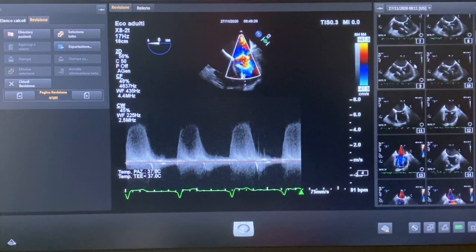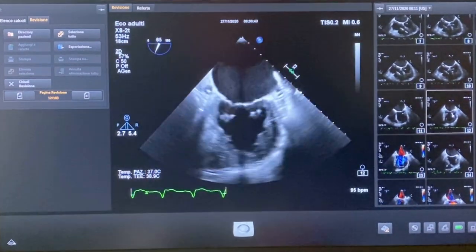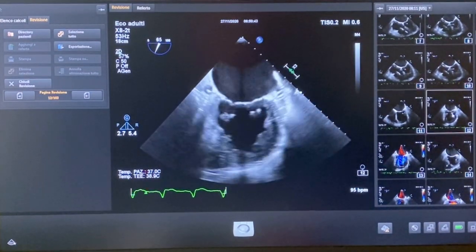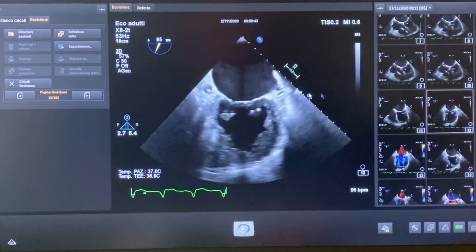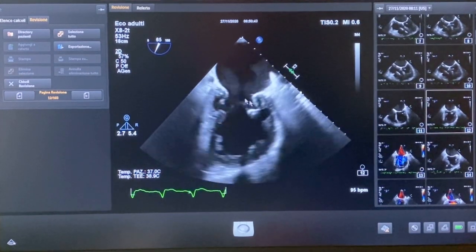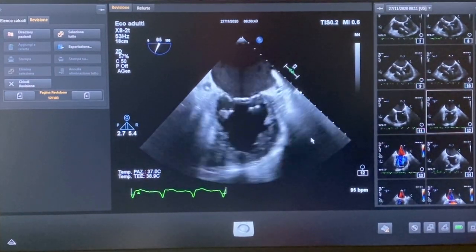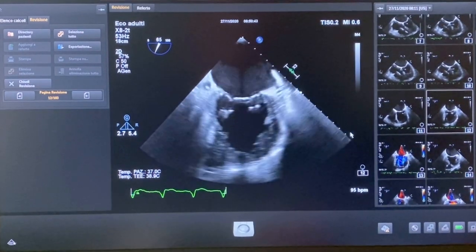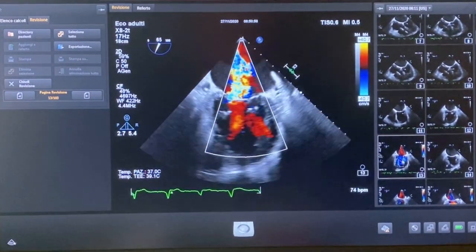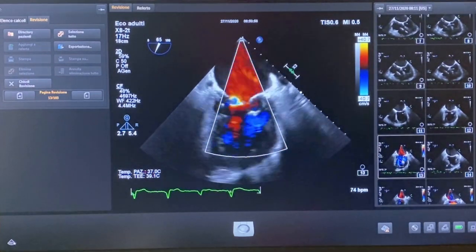Then we go to 60 degrees, where we can see the bicommissural view with P3, A2, and P1. P1 is always close to the left appendage. Here we have the coronary sinus and the two papillary muscles. We then put the color on again and we see the regurgitation jet, which is central and commissural.